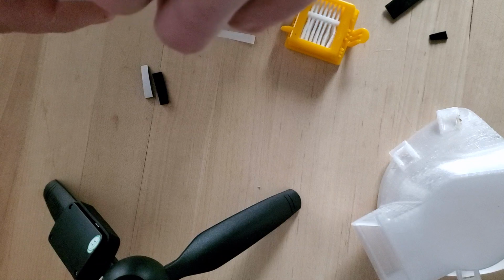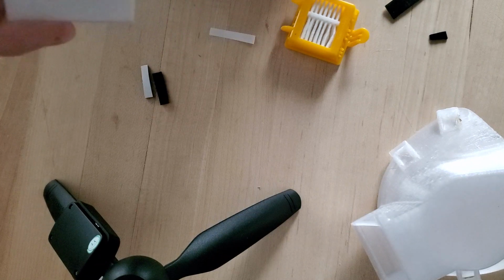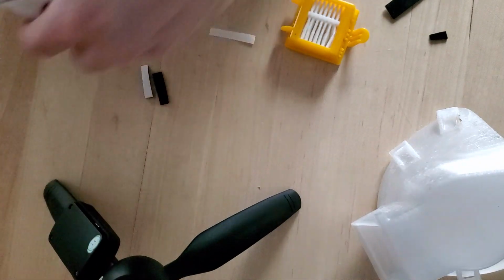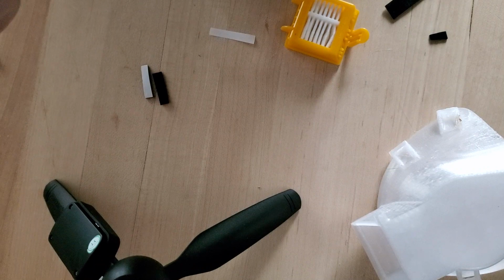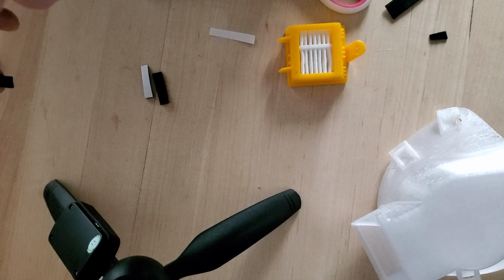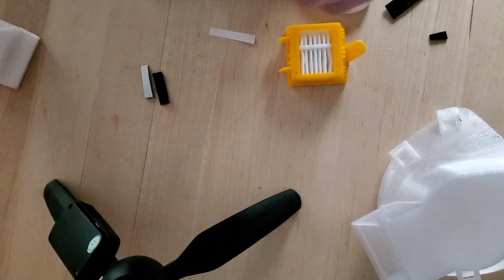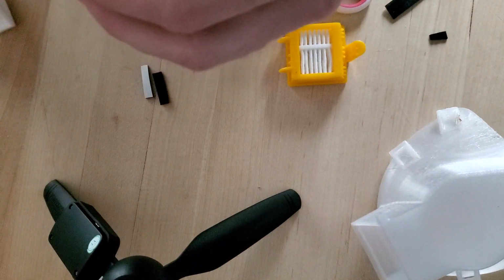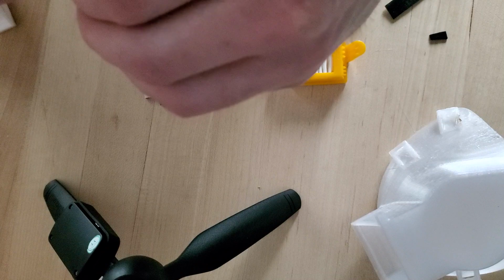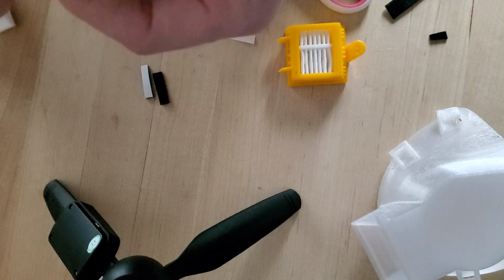If you've got a pair of cotton pliers or, sorry, I can't think right now. Nuts. Well, that can happen. It's not a big deal. I'll have to cut another piece, but cotton pliers or tweezers would be really handy for this. I'm not even about editing that out, sorry. I could, but the truth is it's not easy, so.